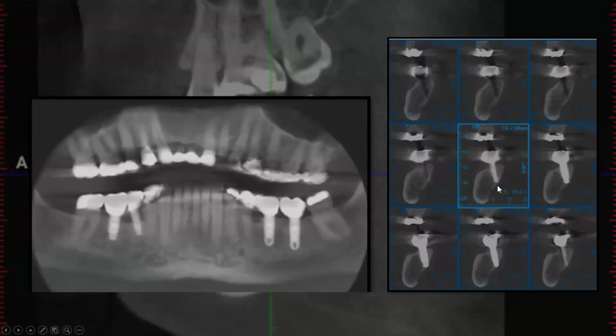But look at the angulation of the implant. Maybe they needed to do that for the restoration planning. But they almost went out and perforated that lingual cortex just a little bit. Probably not enough to be dangerous, but you do have the lingual artery in there. And there are cases of dentists perforating into lingual or other arteries and potentially causing death. So do be aware of these, because we don't know what this bone looks like in cross-sectional image unless we have the 3D.